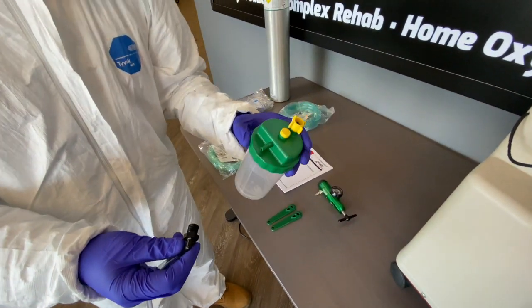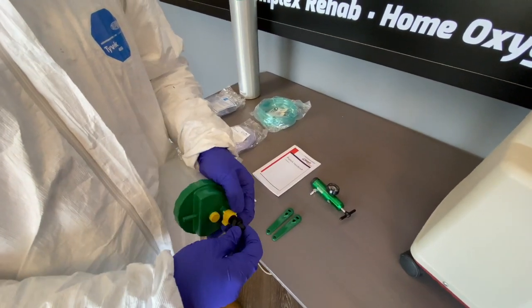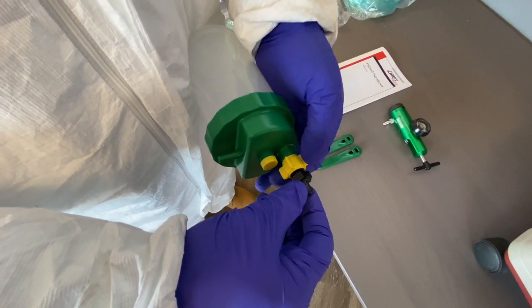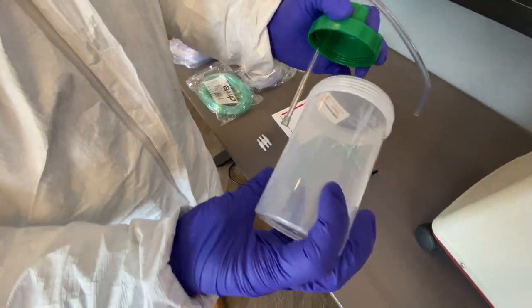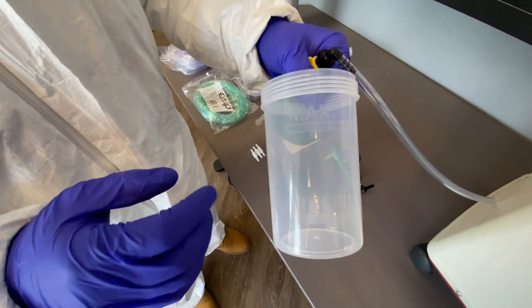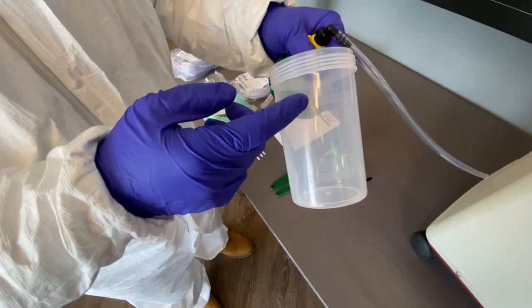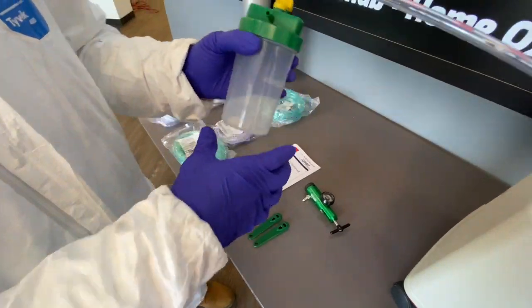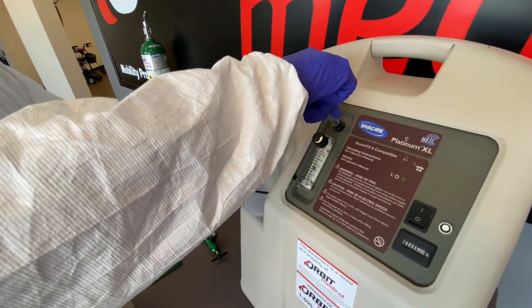We're going to grab the humidifier bottle and then your connector will connect right on top. I'll open this up — there's going to be a max line and a refill line. As you pour only distilled water into the humidifier cup, make sure that you don't exceed the max line. This goes in the left corner of the machine, and this end will plug directly into the concentrator.